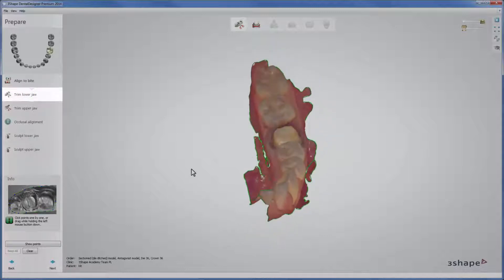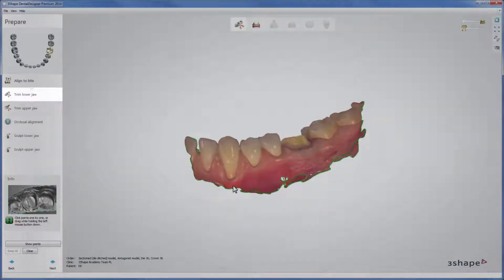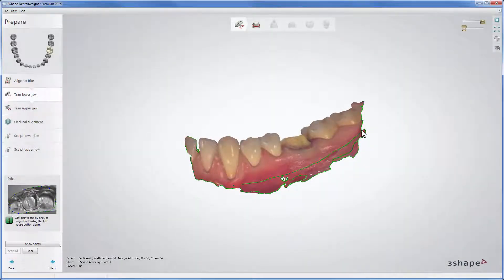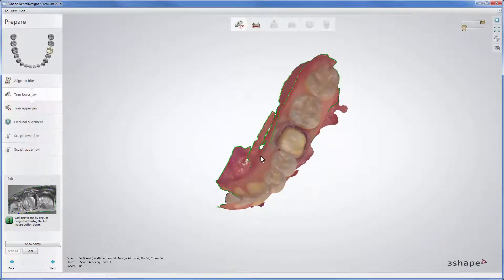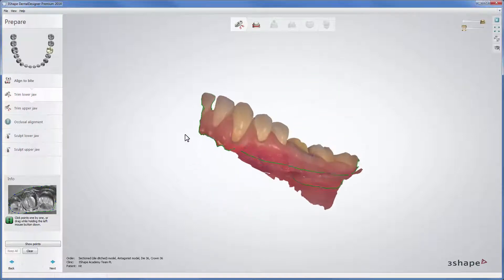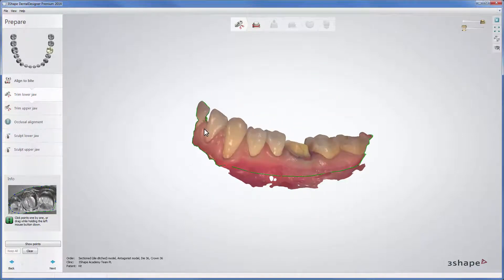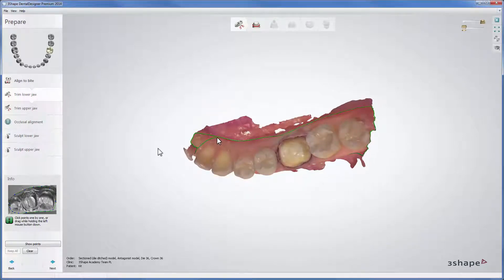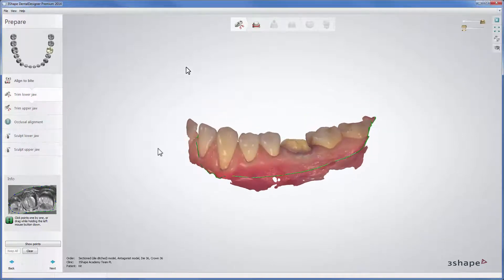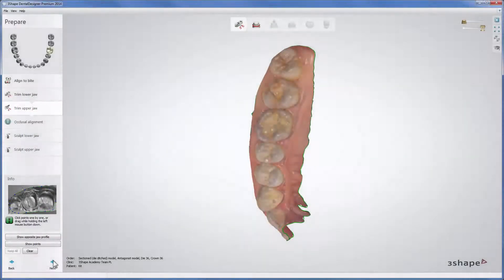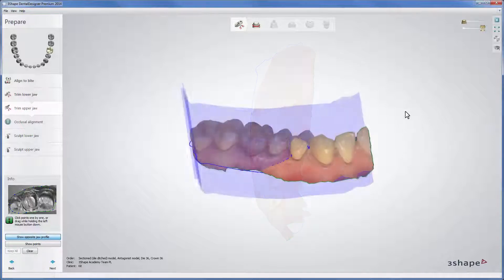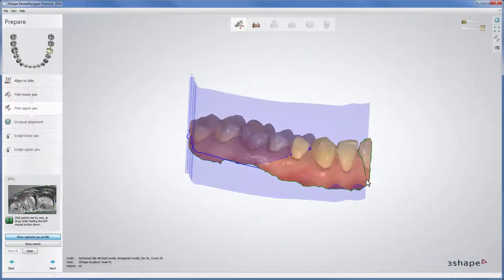Now you are at the stage where you can trim upper and lower jaw scans. This saves time and material if you intend to produce models. Place the spline for the preparation scan first, and then for the antagonist scan after pressing Next. The Show Opposite Jaw Profile option allows you to trim your scan to the same size.